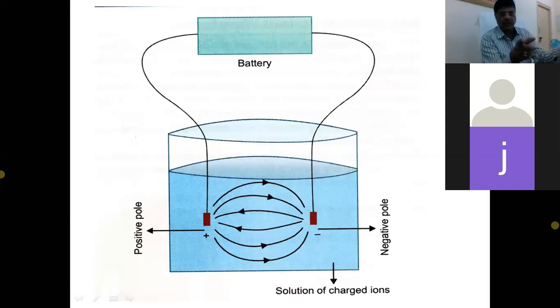It is not just one dipole like what is shown in the slide here. And what is recorded by the ECG leads is the sum of all the dipoles created at that point of time, the average of all those dipoles acting on the surface of the heart. So I'll just repeat this concept again.